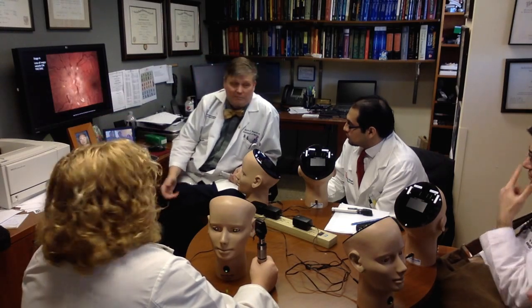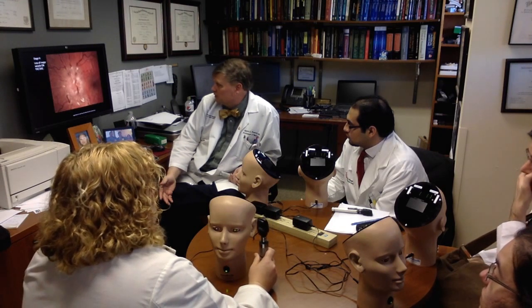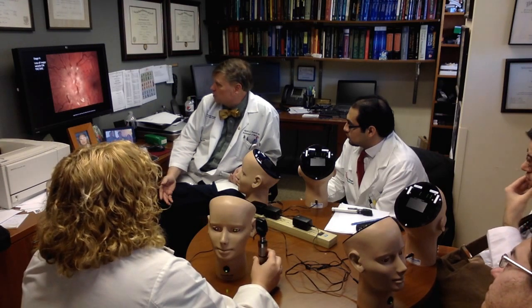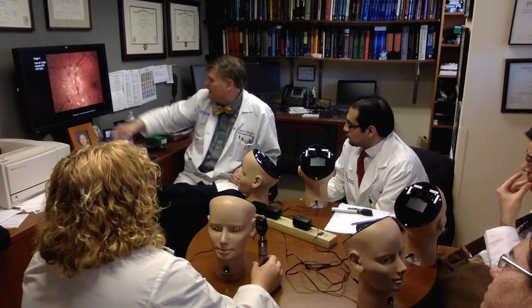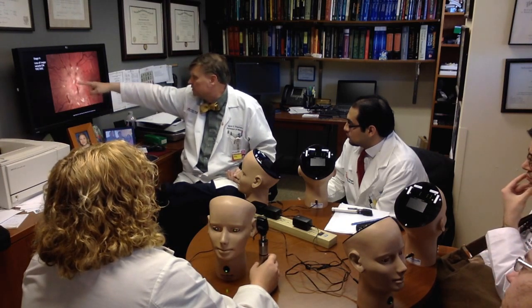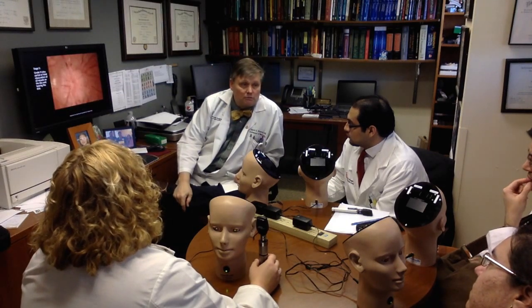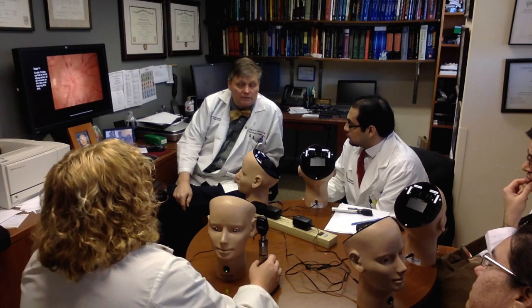Here's grade 4. Man, I don't see any cup at all. It's incredibly blurred. The vessels are really engorged and tortuous. And now the major blood vessels, we're just losing them. We still see 1 or 2. And grade 5 is total obscuration of the disc.